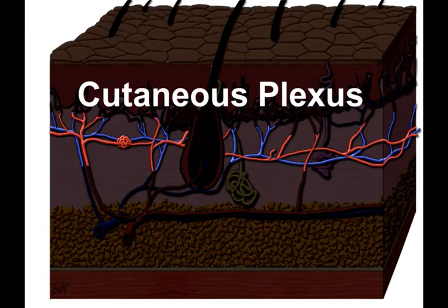Both can involve the perforators, and so when we talk about superficial, we really talk about the superficial plexus, the postcapillary venule, and superficial and deep as being both that level and the vessels at the dermal subcutaneous junction.